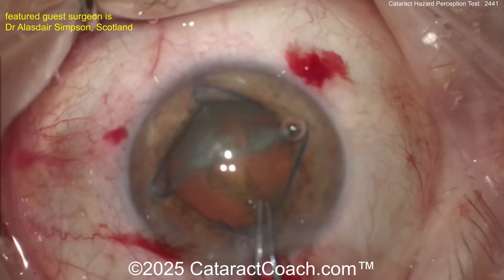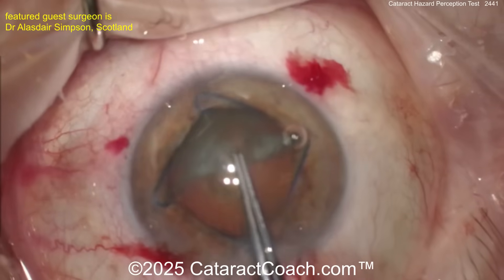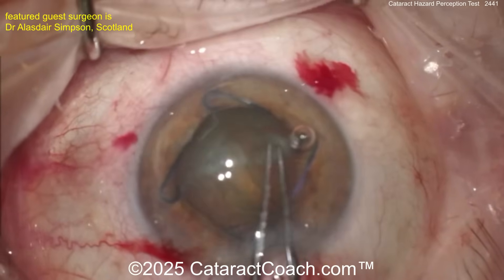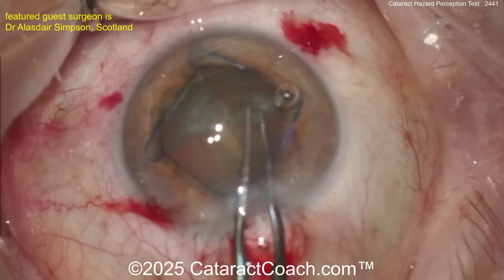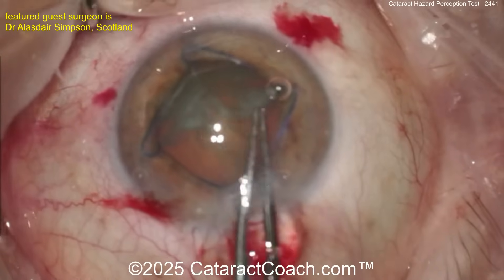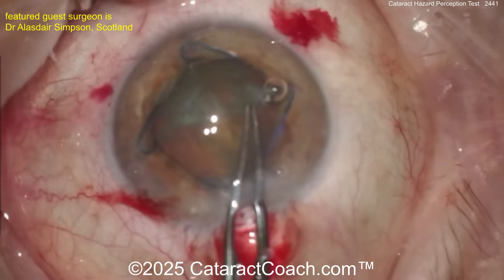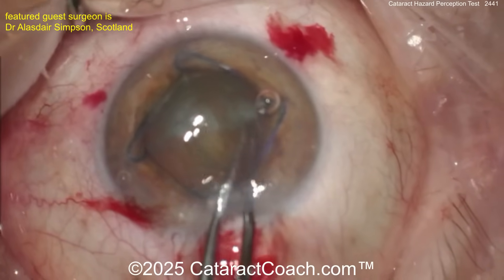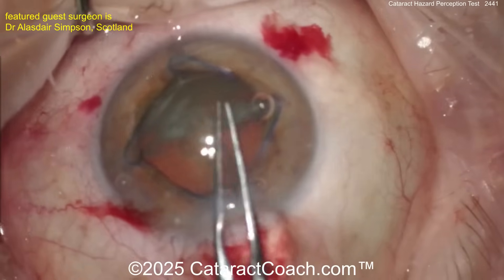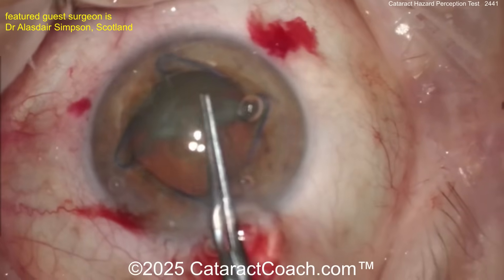Clip three — you've got a Malugan ring in the eye. How's your view? Where's the rhexis edge? There it is. Don't let go of the rhexis over that opaque cortex, because now you don't know where it is. You didn't have to use trypan blue dye, but if you're not doing that, you can't let go of the rhexis over the opaque areas of cortex — now it's impossible to see the edge. That's an issue.